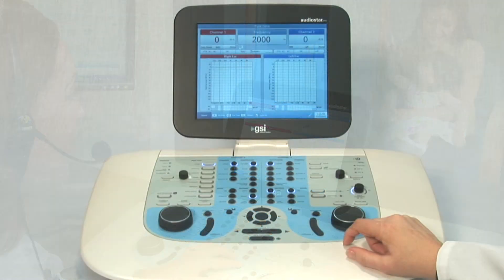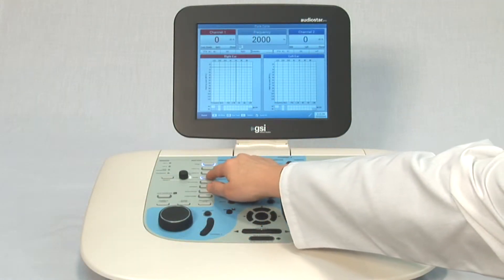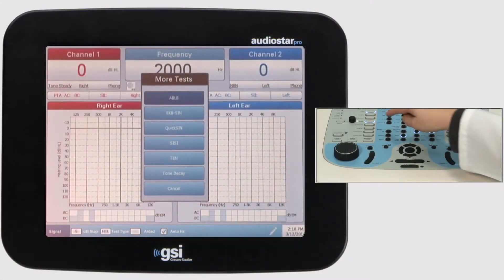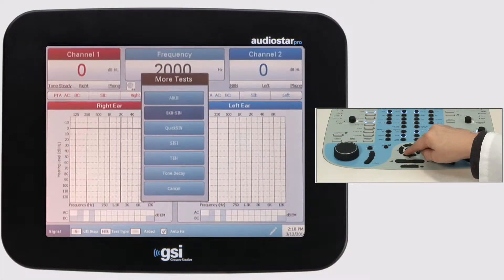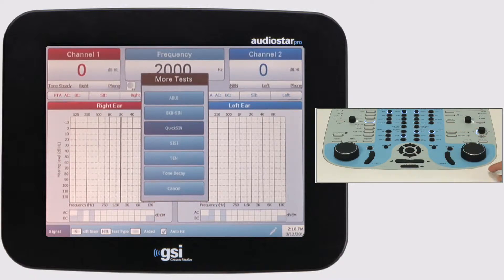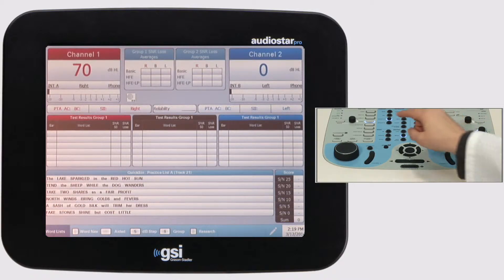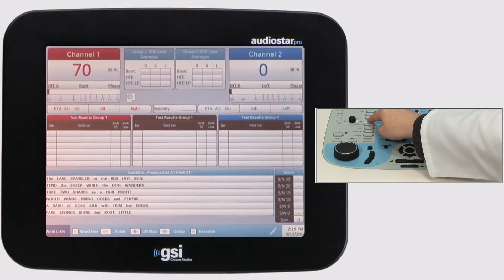To access the QuickSIN, press the More Test Type button and select QuickSIN. This test is appropriate for testing adults and provides a fast method of evaluating a patient's ability to understand speech in noise.